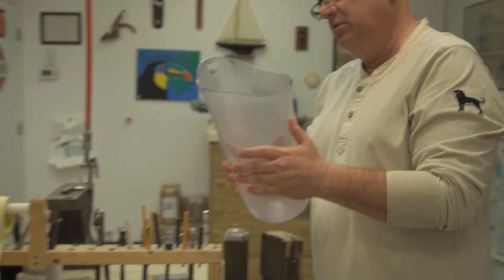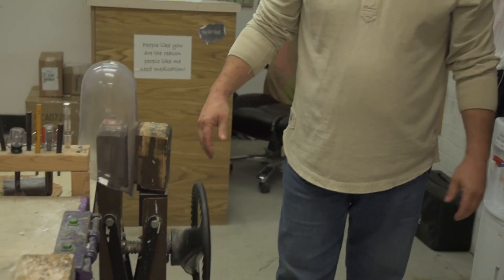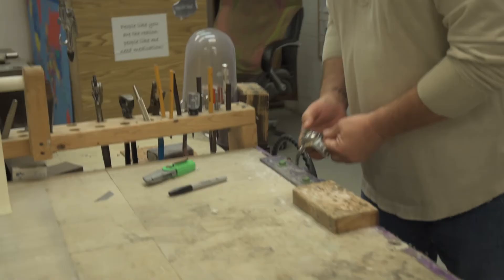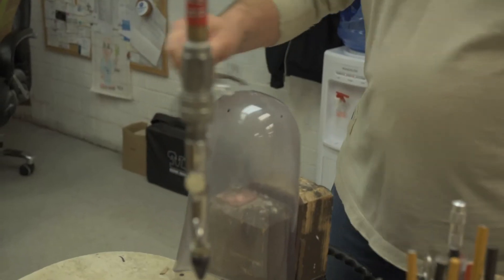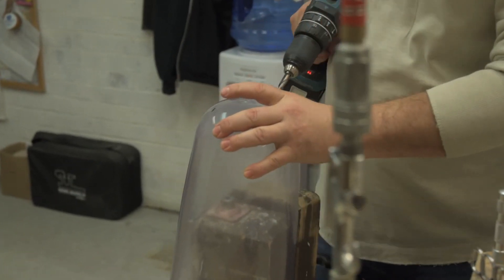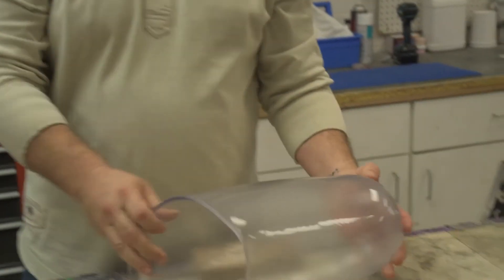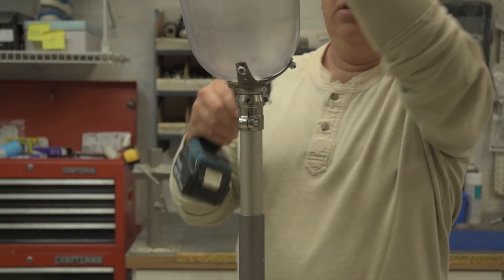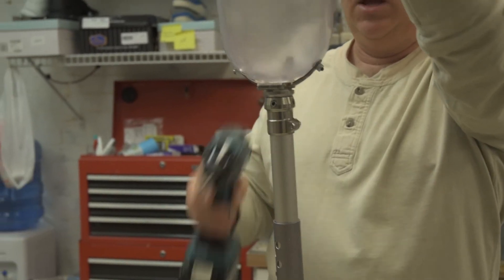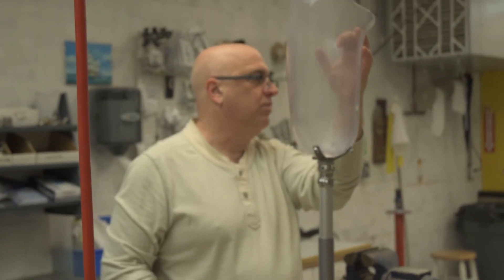This is an above-knee amputation — this guy was in a motorcycle wreck and lost his leg. This is a limb vice with a nice steering wheel on it. We'll drill those out. This is my pogo stick setup so I can have them stand and put weight on it, and then I can do all my mods and drawing on that.